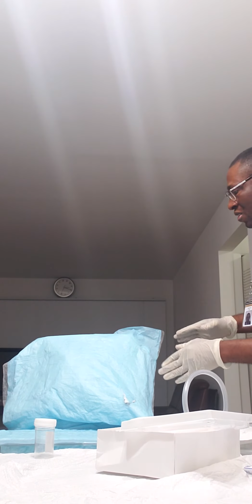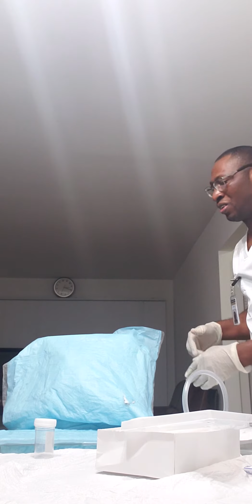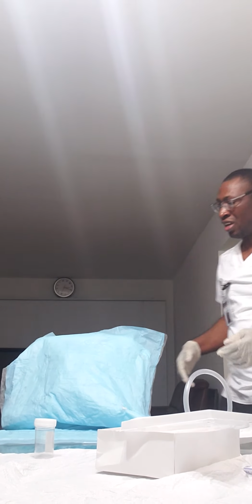Are you comfortable now? All right. Do you feel any pain? No pain. Okay, good. So clean up the bed, clean everywhere up, and get the bed down. Raise the handrail and remove my gloves. Perform my hand hygiene, and this is a call light. Just call me if you need anything. Okay, all right. Thank you very much.